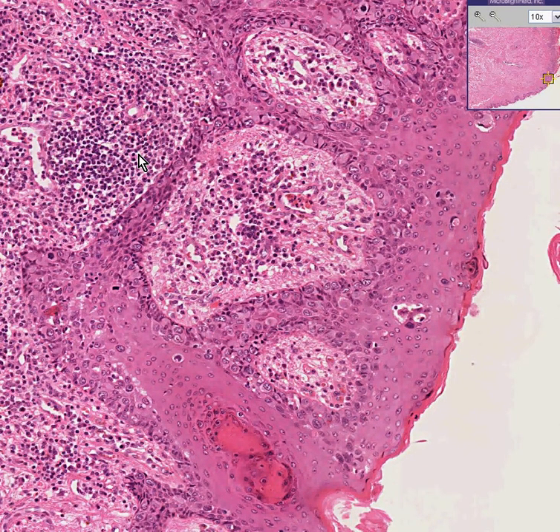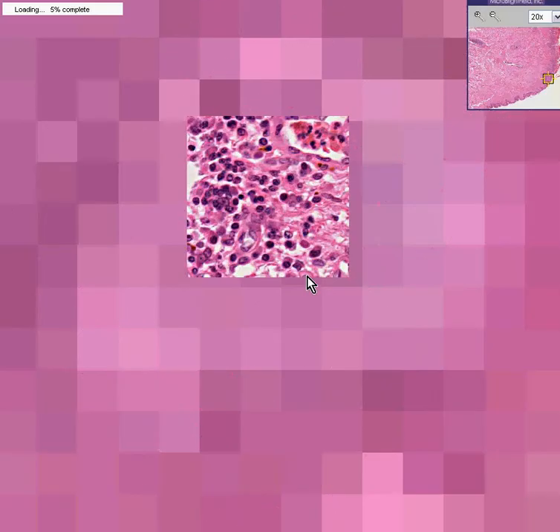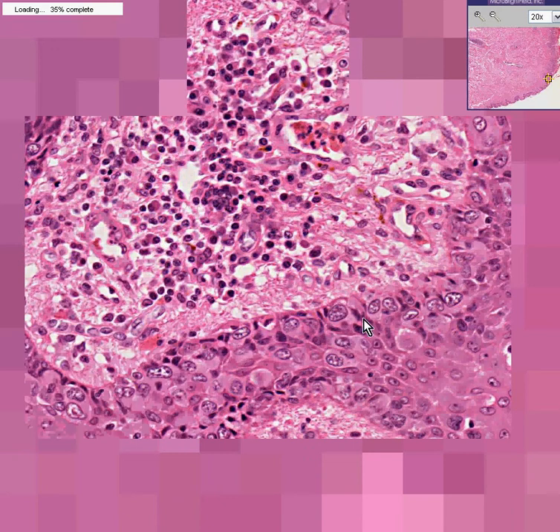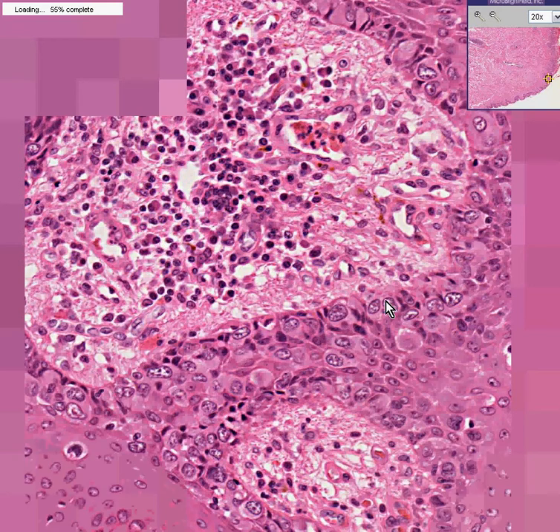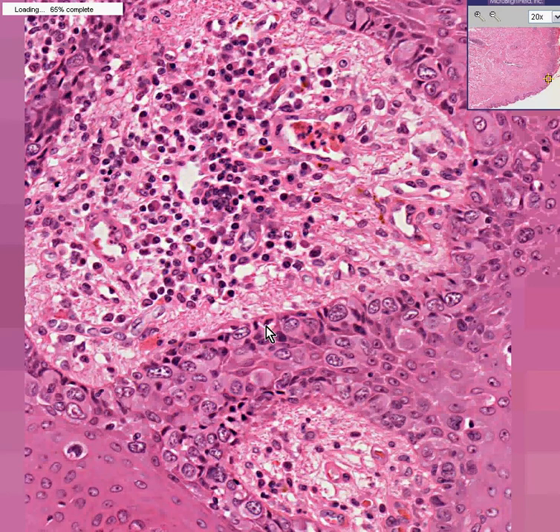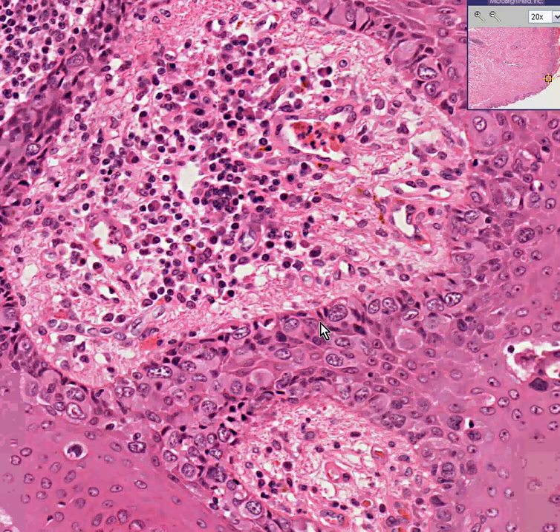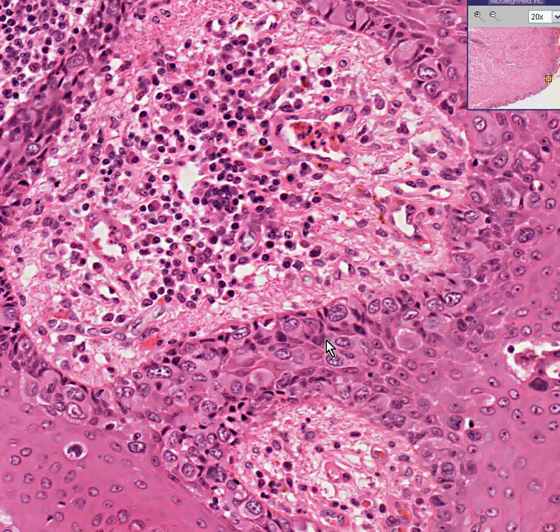You can also notice that these ballooned Pagetoid cells are limited to the good side of the basement membrane. And this is not an infiltrating carcinoma, even though they are malignant cells. That's the good news.